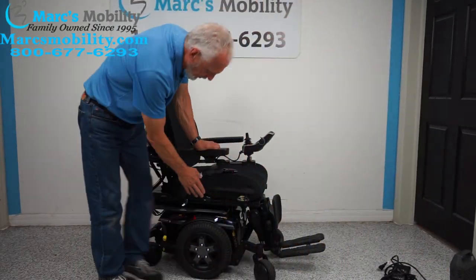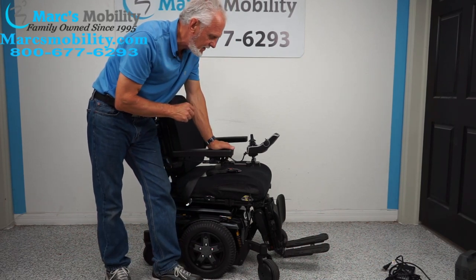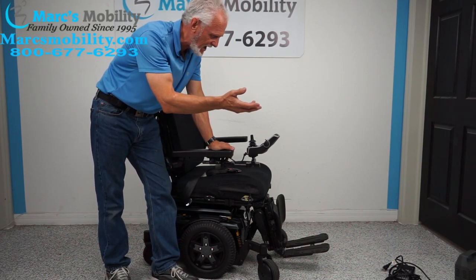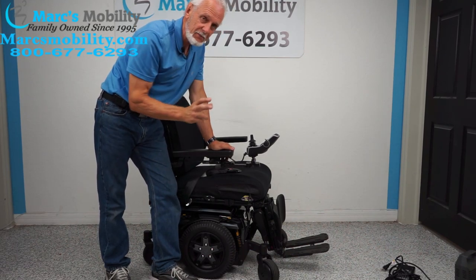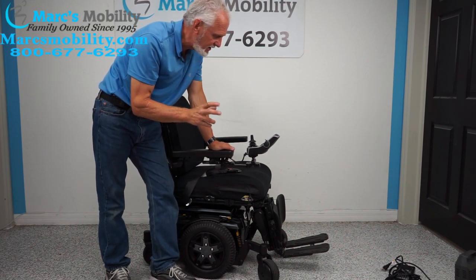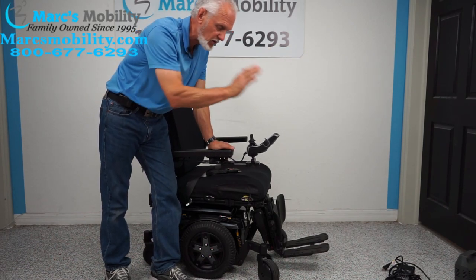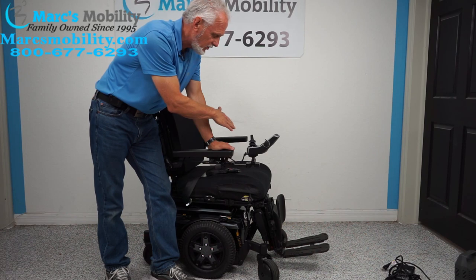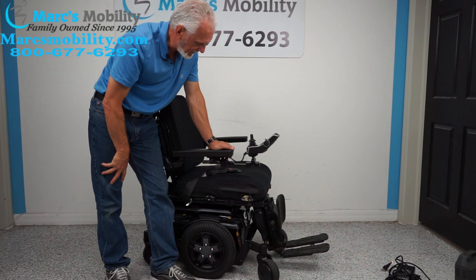This chair has a 300-pound weight capacity, a top speed of 6 miles an hour, and a range of up to 15 miles on one battery charge. Up to 15 miles means best-case conditions — if you're outside going uphill, in the grass, going fast with a heavier user, you won't get 15 miles, but you'll still get a long, long way.